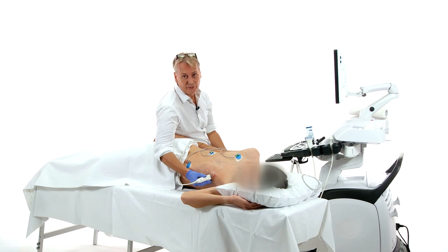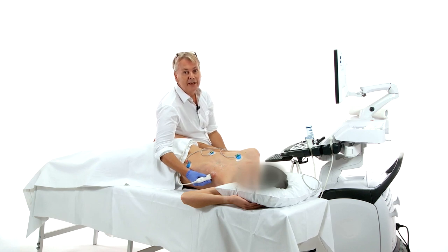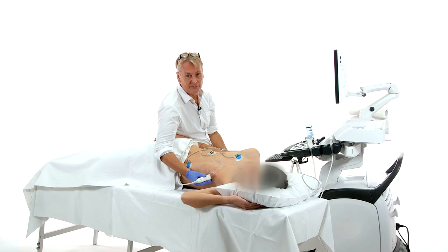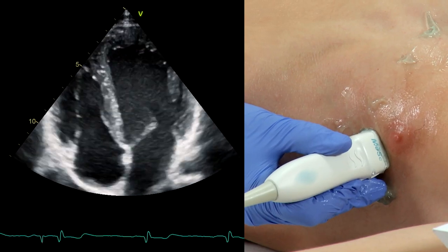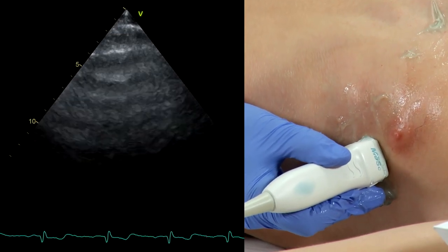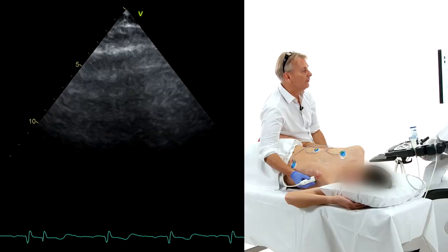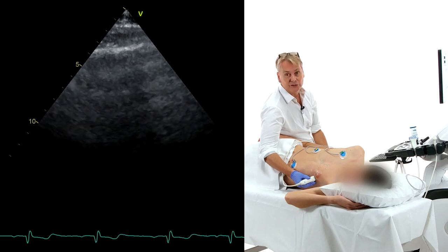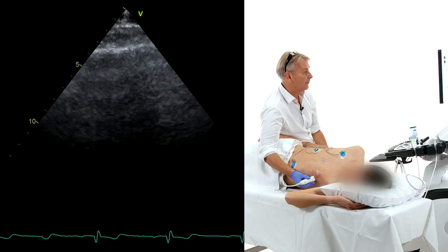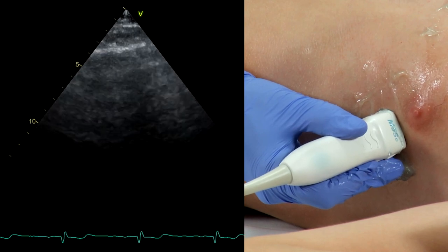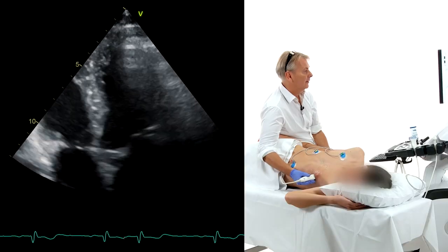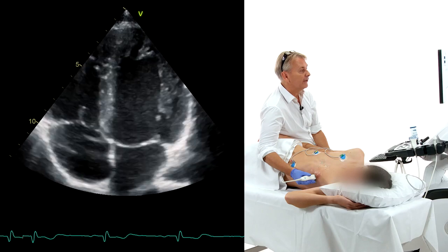Air is one of the biggest enemies of ultrasound, and very frequently you'll have air interfering with your image, especially from the lung. Let me show you what happens if I ask my patient here to inhale. All of a sudden you will not get a window — all you will get is strong reflections from the lung. But you can use the respiration to your advantage and get a much better image.